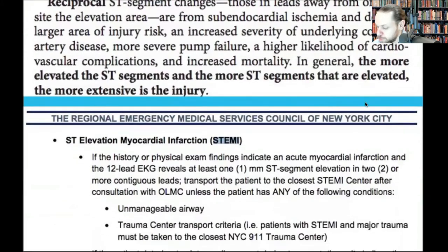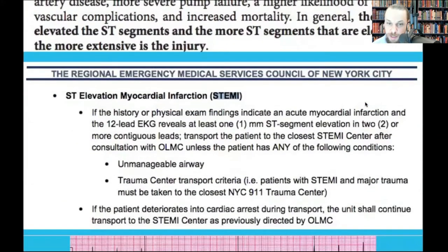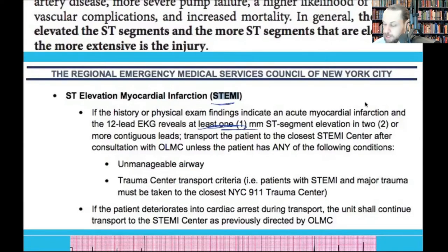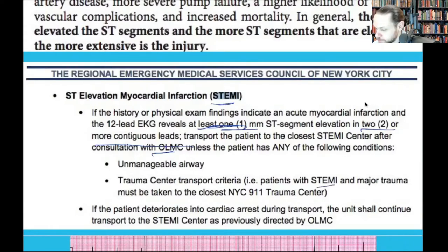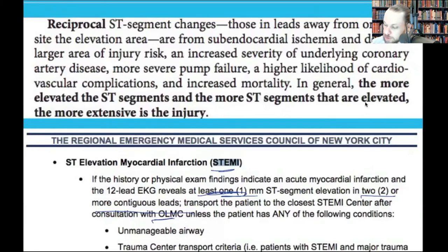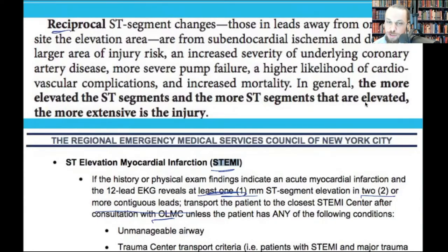Per REMAC protocols, any time you have at least one millimeter ST segment elevation in two or more contiguous leads, you call online medical control, transmit your EKG, and they authorize you to take the patient to the STEMI center. Reciprocal changes — depressions on the opposite side — are very specific and sensitive for MI.